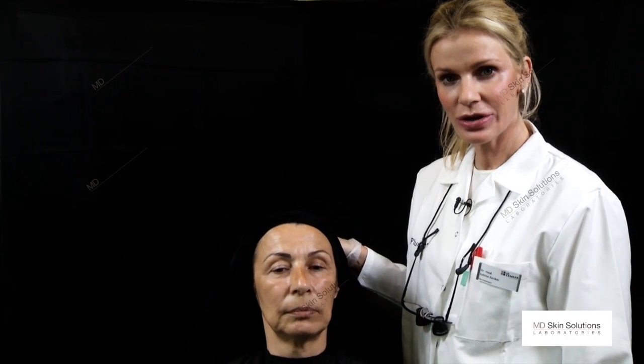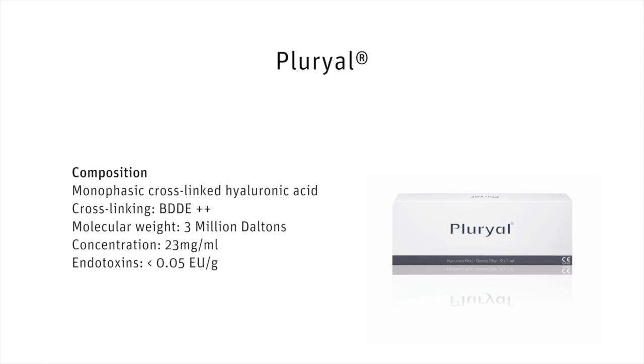This section will show the use of the Pluryal filler line. Pluryal fillers are hyaluronic acid fillers, monophasic, cross-linked with BDDE, with a very low endotoxin level. So we will show a case of Pluryal and Pluryal Volume.